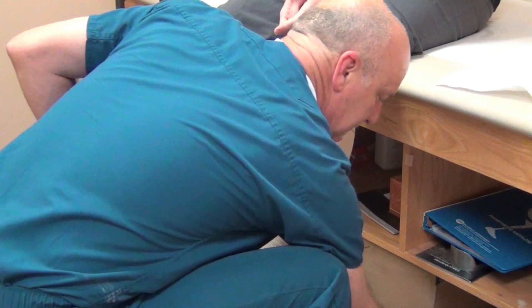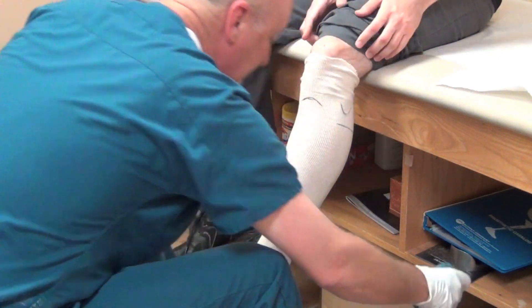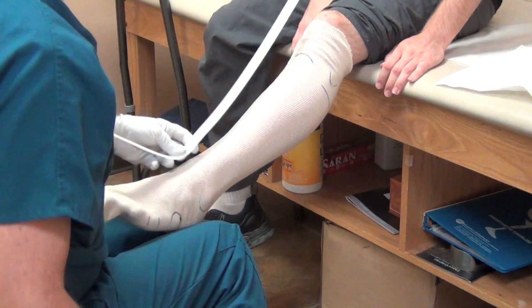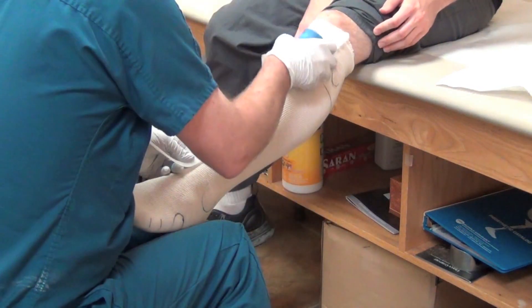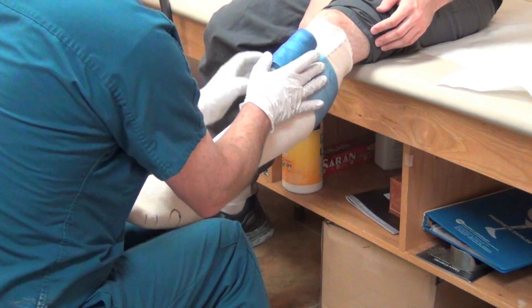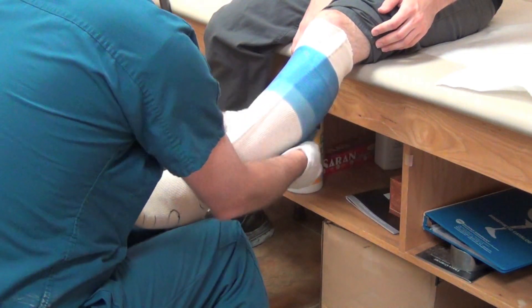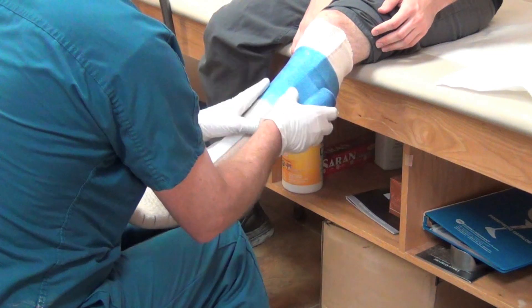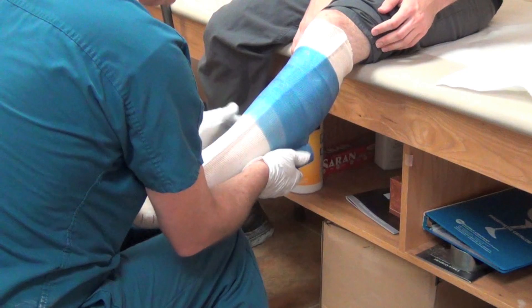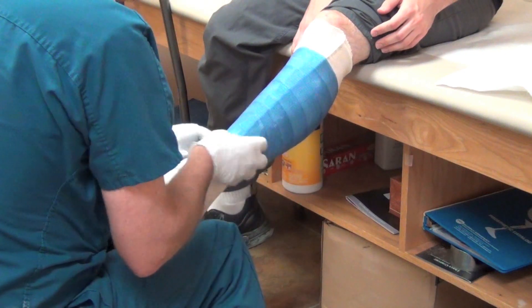For my technique, I start at the top and work my way down. What's important is that we get a good, accurate representation of the leg. I do two rolls at the top, then go down and divide that into about thirds. Don't put any tension on your casting material — that's what causes wrinkles or bumps in your model. Just lay it on, overlap by thirds. You can give it a gentle tug if you've got a little wrinkle, but don't stretch it or pull on it.